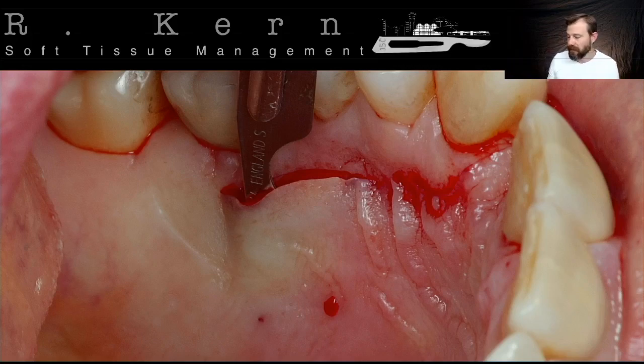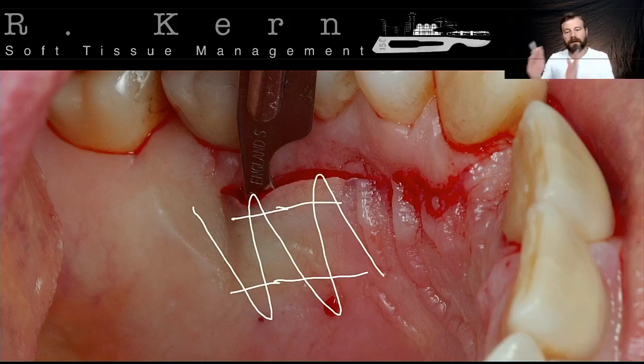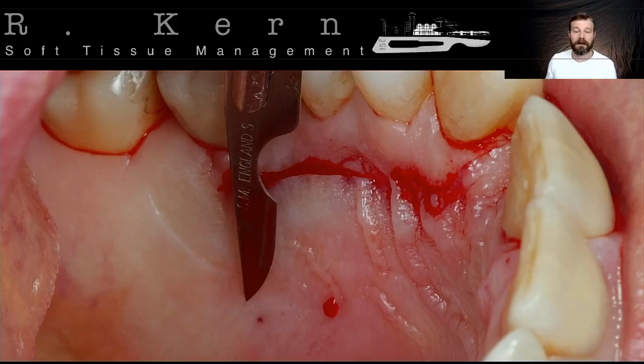Of course, I told you about the width of the pediculum. I told you that you need to prepare an area to reach the pediculum here. But how apical do you need to prepare this area? When you calculate the width necessary and some extra width to open a window, you're going to know exactly how deep you need to work with your blade, okay? And look at the previous slide here. I'm just checking how deep I'm going to bury the neck of my blade inside the tissue, to achieve and to maintain that level.